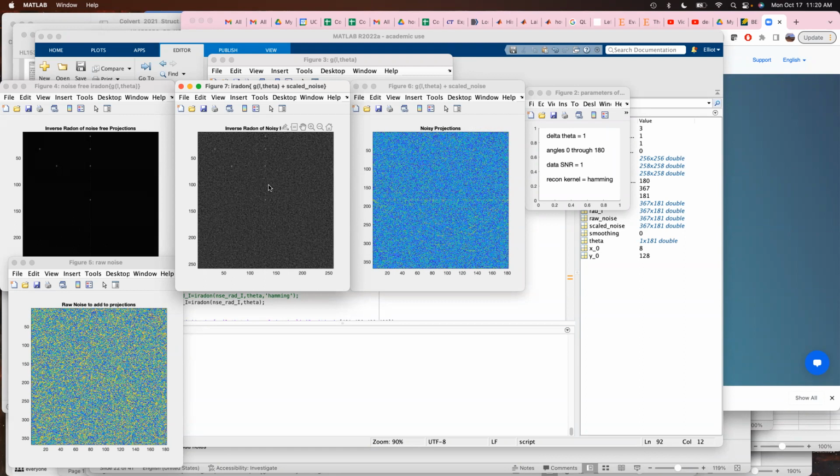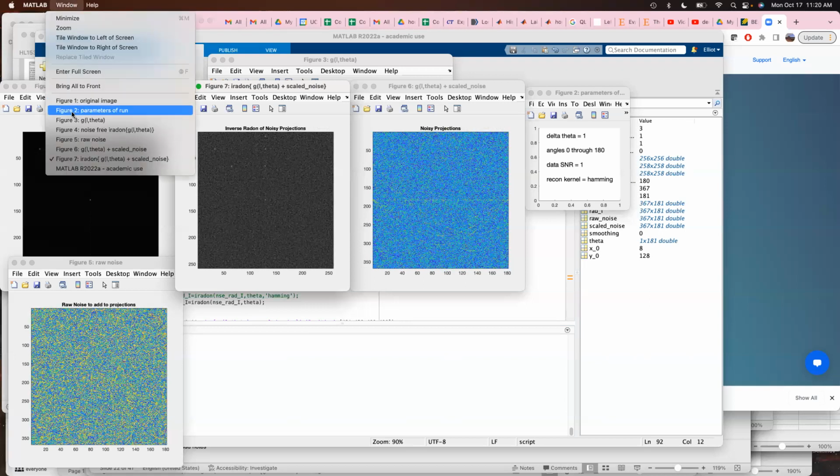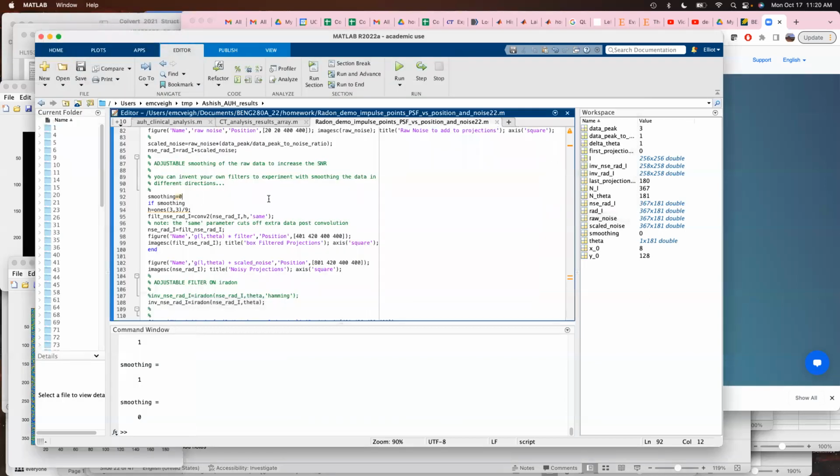So often what you can do is do your first image reconstruction and then find areas or objects that you're interested in, and go back into the raw data and pay attention to those spots and do some kind of least squares estimate or noise reduction so that you bring out those objects.